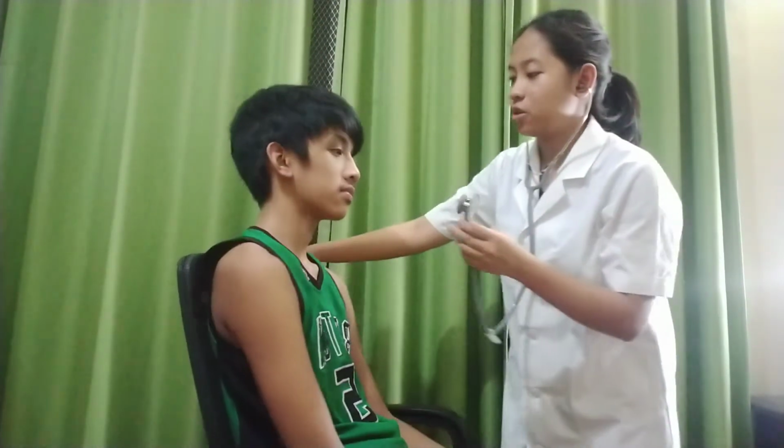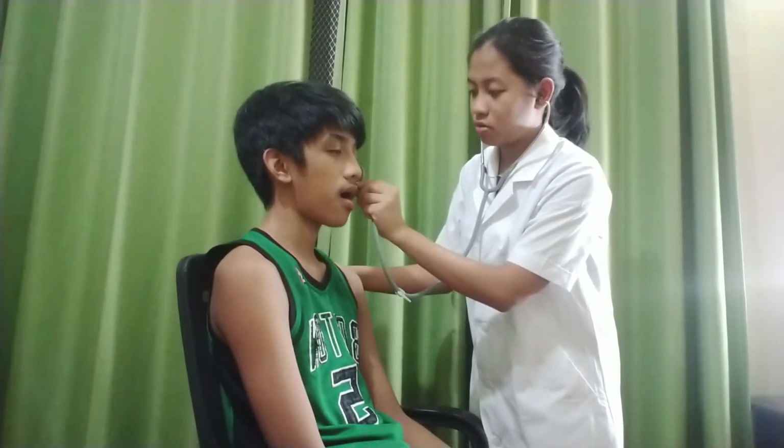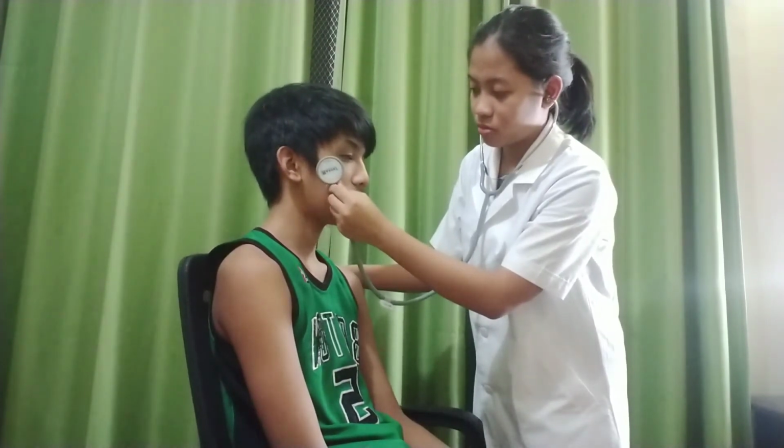Now I will remove my hand and I will place the diaphragm of my stethoscope over the joint, and I will listen for any sound when the client opens and closes his mouth. So, sir, open and close the mouth ulit po. Okay, open. The other one. Okay. There are no abnormal sounds like cracking of the joint observed, so there is a clear sound when the client opens and closes his mouth.